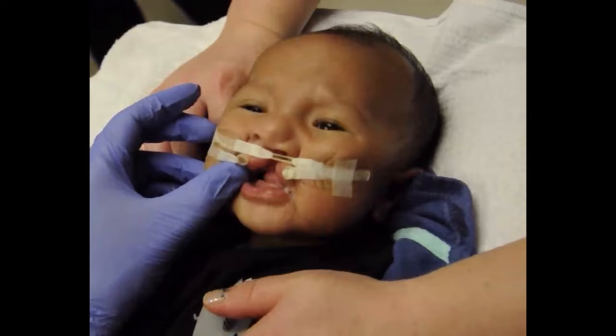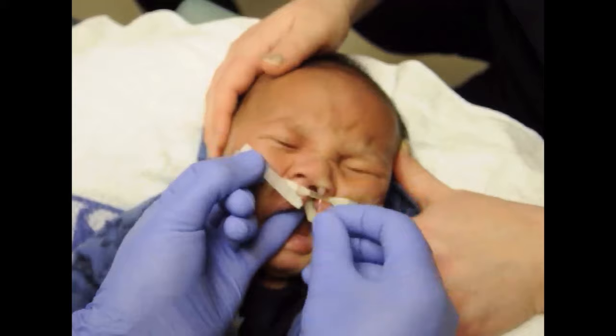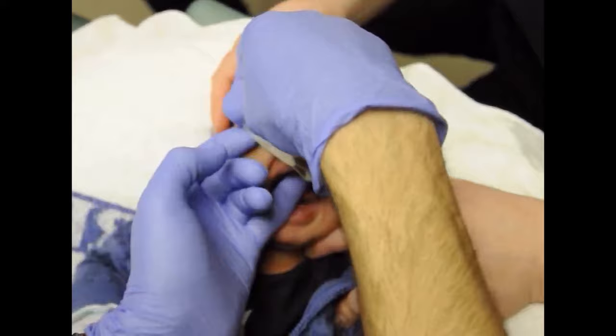When the gap between the gums has been reduced to approximately five millimeters, a nasal stent is added to the molding plate. The soft pink acrylic of the nasal stent should rest on the nostril rim to lift and shape the nose.